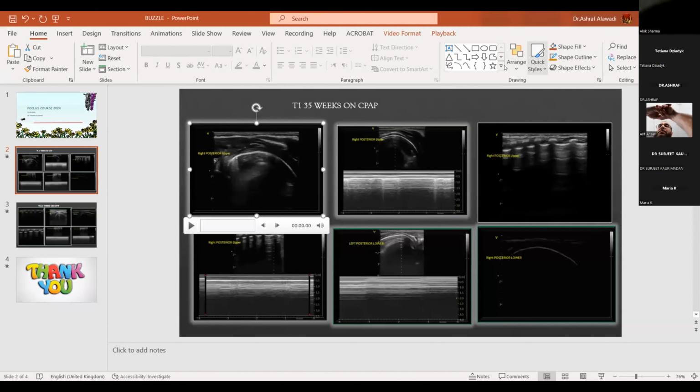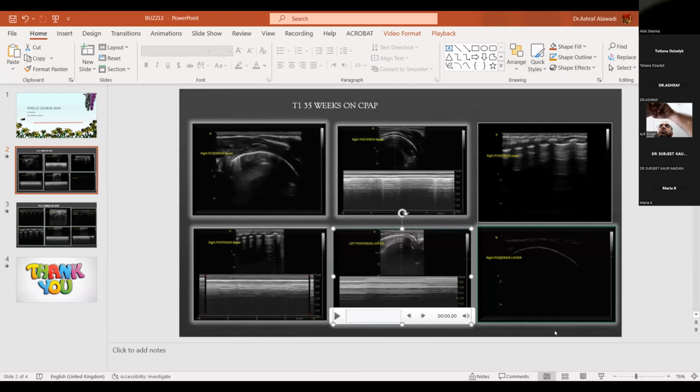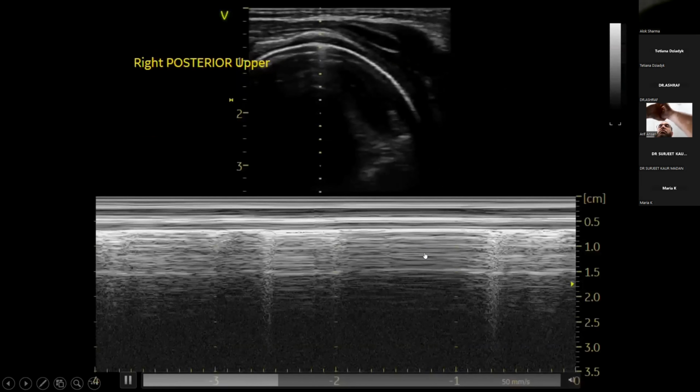See this one. The problem is that I made it full screen. I see there's maybe something. Okay.